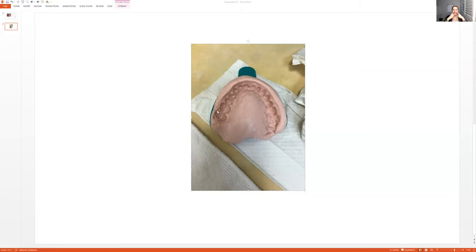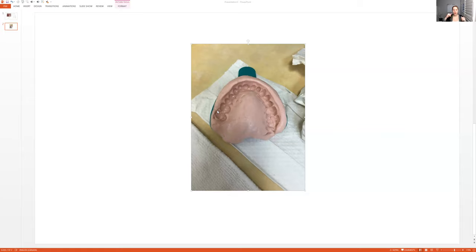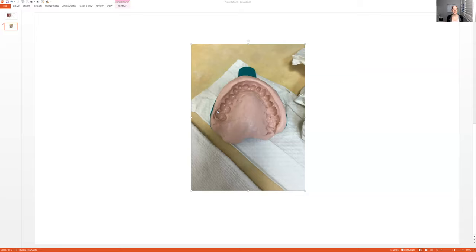Go in, do that. Or sometimes you can just simply like pull and it comes down, but that never seems to work for me. So I have to go in and push down. I do the same thing for the bottom too, but I would obviously go in and push up, but on the bottom, there's not as much suction because the tongue's in the way. So it's a bit easier, but then you just take it out and then I wrap it in a damp paper towel. So I take a paper towel, I put some tap water on it and then I wrap it and then show the dentist afterwards.